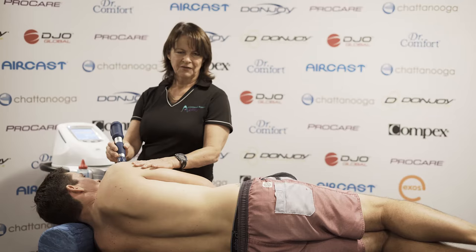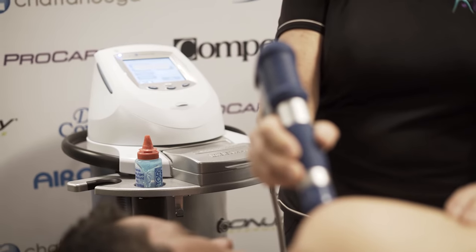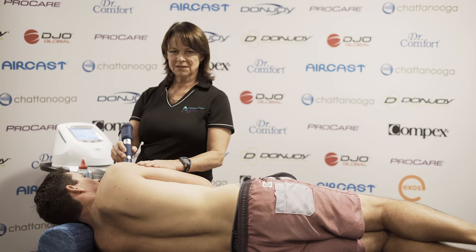The treatment lasts for 15 to 20 minutes, depending on the area that we need to cover. The usual treatment regime is a five to seven day gap between each session, going for four to six sessions in total.